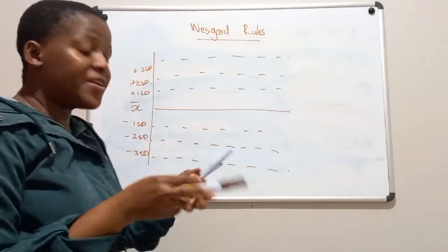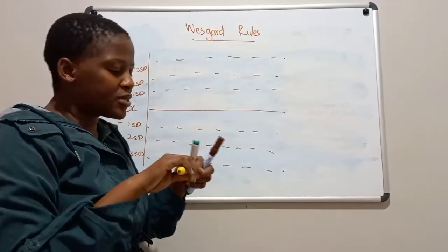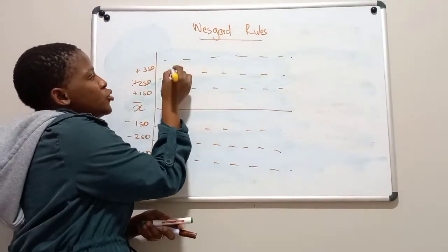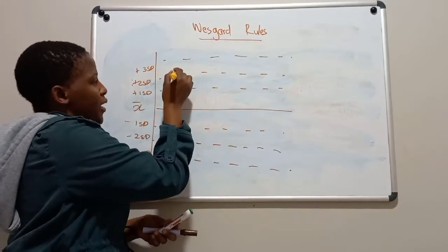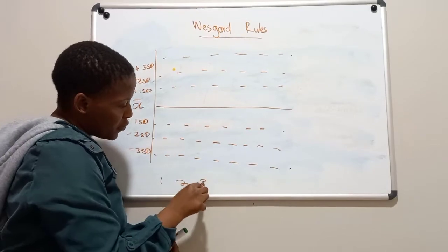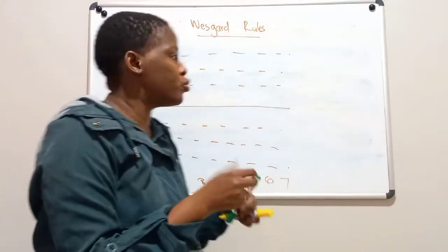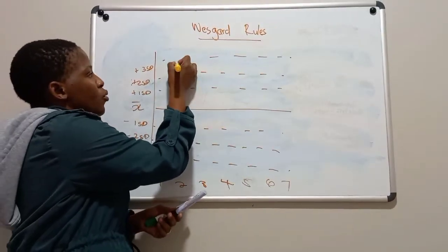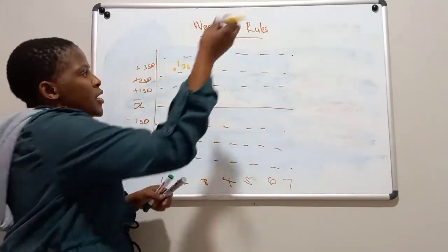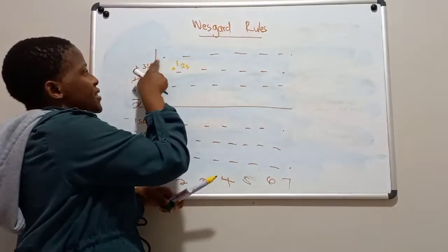So the first rule that we learned about is that you have 1 point that is outside the 2SD. So here is the 2SD. Let's say you have a point here, because again on your x-axis you're going to have the number of days or the dates that you'll be running your QC material. So there is your 1-2S. And then the other one that we learned was the 1-3S. So there is the 3SD.